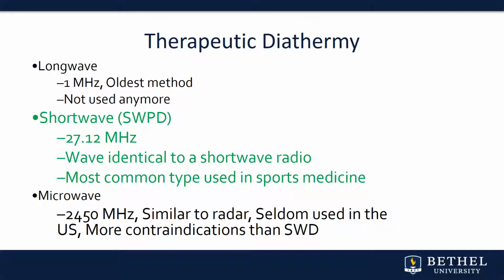It's seldom used in the United States, partly because there are so many contraindications with shortwave or microwave diathermy. For example, hot spots can be created by sweat that accumulates, so you have to keep that all wiped off. If there's any metal in the area, that'll be preferentially heated, so you have to make sure you have a room with no metal in it. So just lots of things to be concerned about, and it makes it more tedious to use.